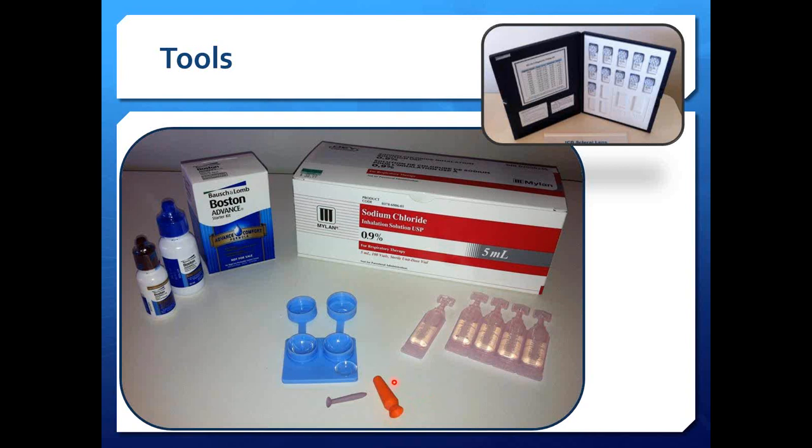What we don't want is for a patient that's struggling with the initial insertion, they're new to scleral lenses, maybe new to contact lenses, we don't want the lens being stuck on the suction cup the second they place it on eye. If the suction is gone, as soon as the fluid squeezes itself out, then that lens will stay on eye.